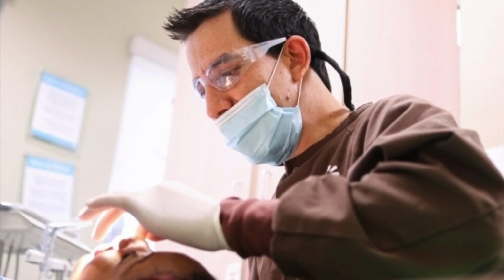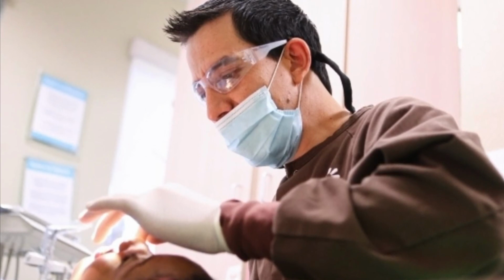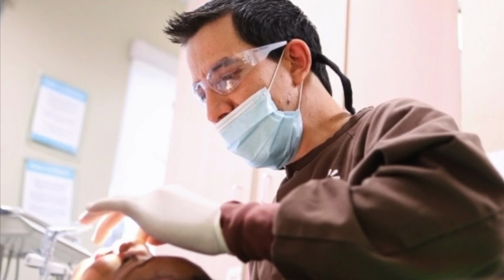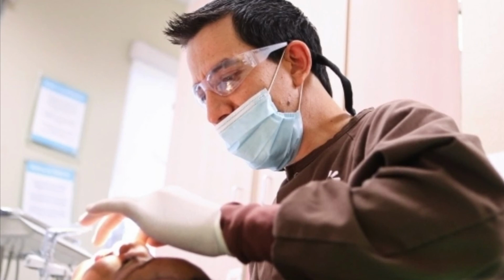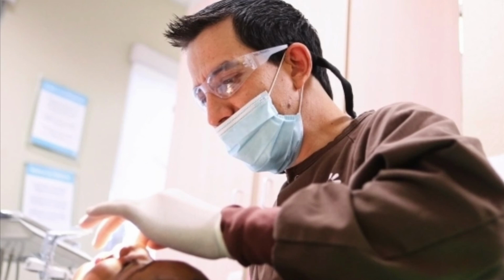The cutting efficiency and flexibility are greater than the K-type file with the rectangular cross-section, and this one is called the K-flex file. The K-flex file is a twisted instrument with a series of cutting flutes, and its cross-section is a rhomboid.